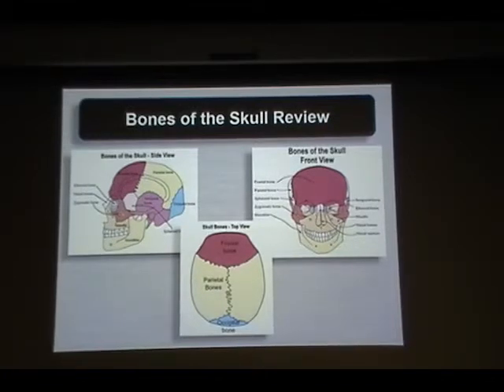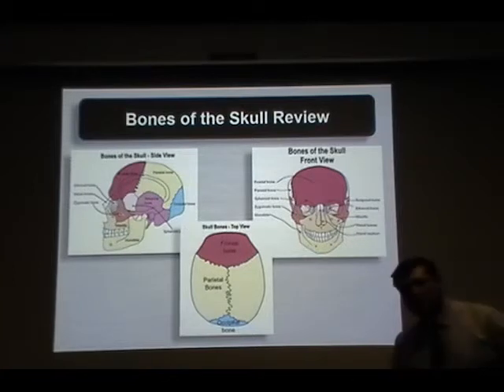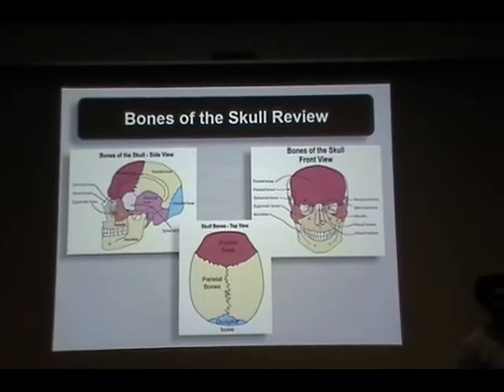So when we take a CBCT scan, we capture, depending on the volume. When I say volume, it is nothing but how much of the structure you are trying to capture. It could be 15 by 15. So if you're going to become an orthodontist, or an oral surgeon, then you need to capture from here to here, the scan.